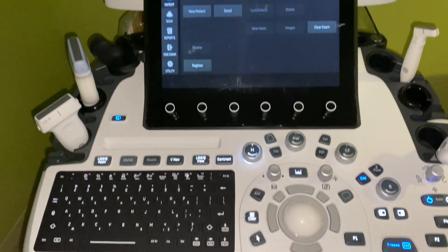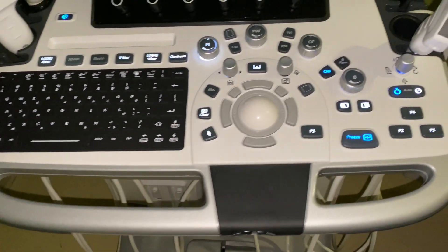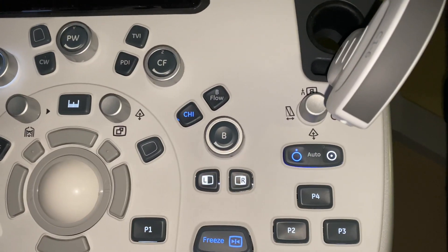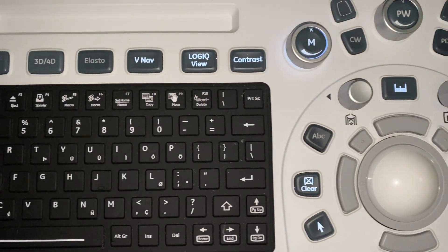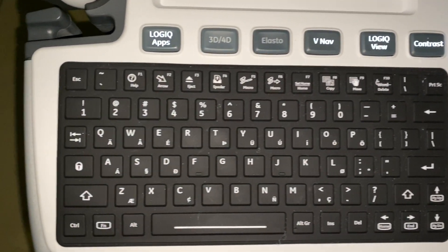Hey everyone, how's it going? We just got the new GE Logic E10 and I want to go over a few cases just to show the capability of imaging on this new machine.